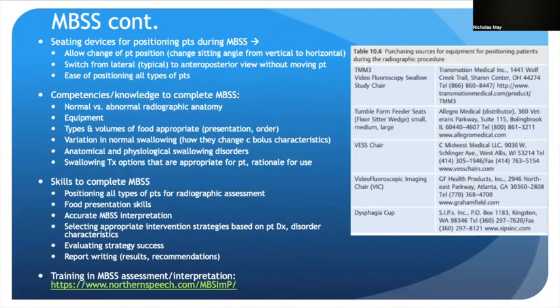And relative to the positioning of the patient during the modified barium swallow study exam, there are certain devices that exist for positioning patients that facilitate a range of angles and views, so lateral versus anterior posterior view, without the patient having to move, which is very convenient. And so some of these are listed in your textbook here. This might be a bit of a dated list now. It's good to see what is available in your area.